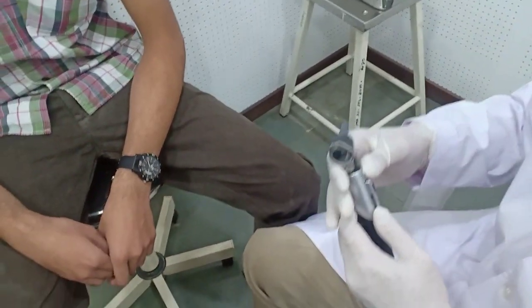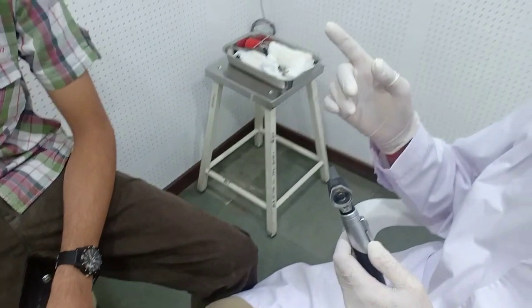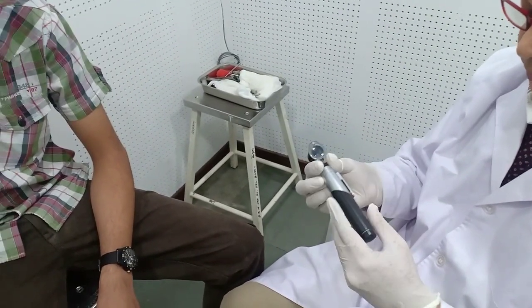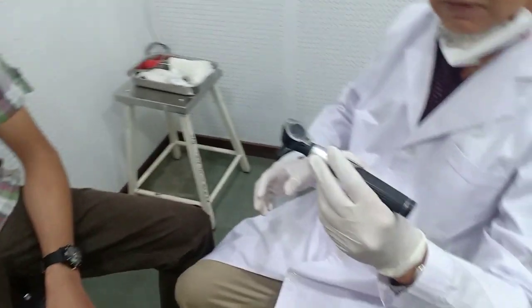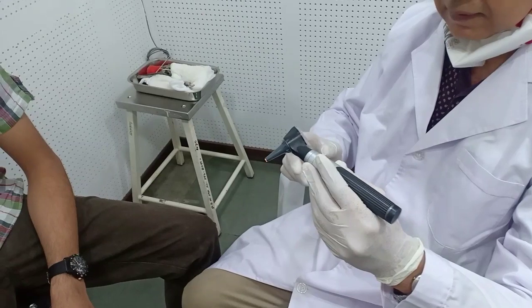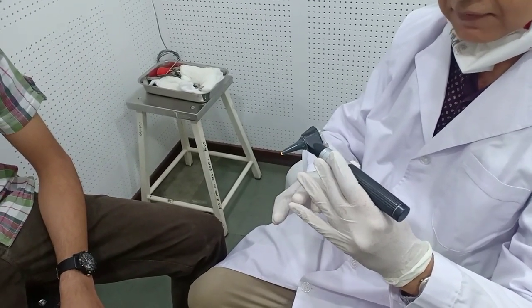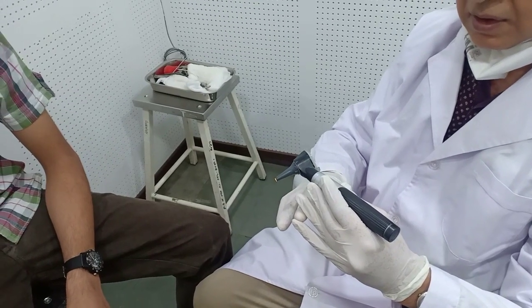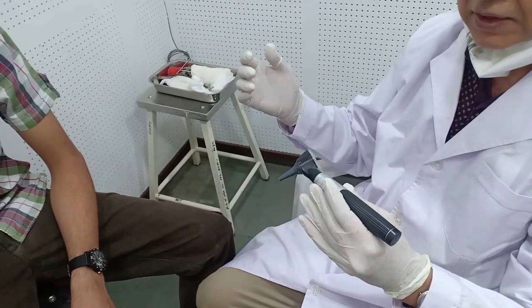Let us now first examine the left ear of the patient. I am holding it in my left hand, like a pen, like this. The little finger should touch the patient's face, and with the right hand we will be retracting the pinna.